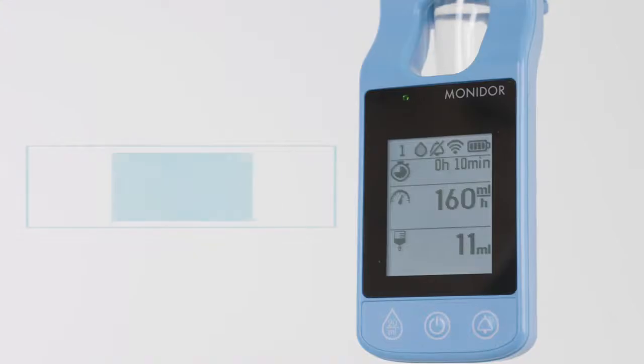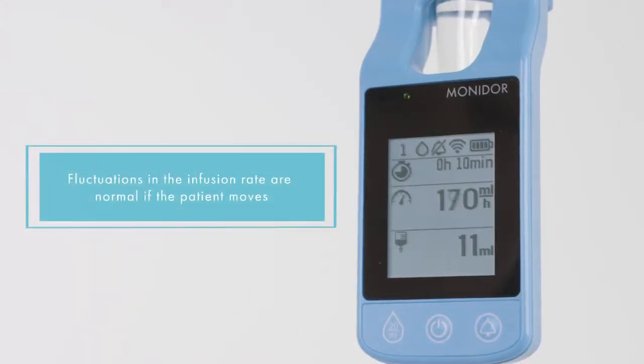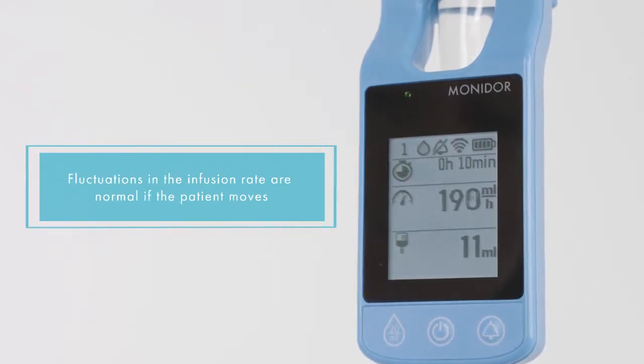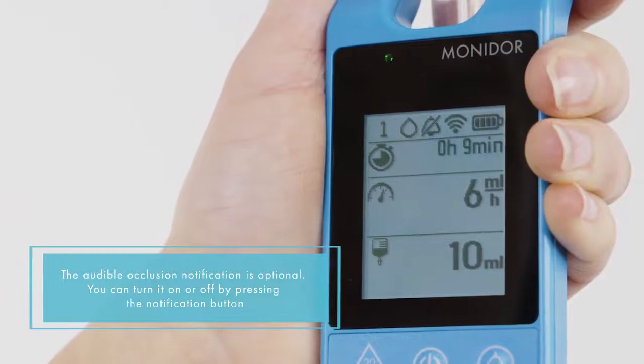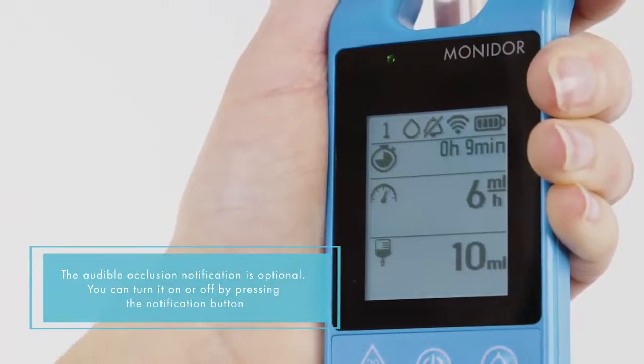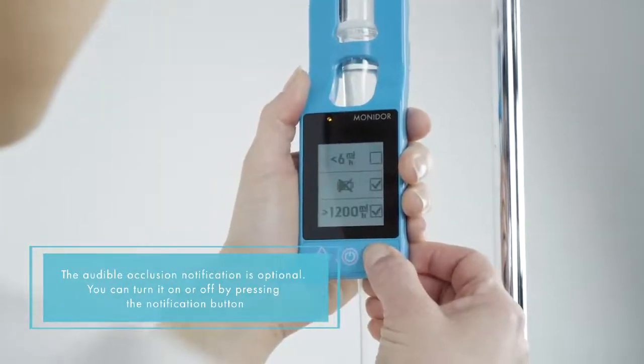The MoniDrop device doesn't adjust the infusion rate. Fluctuations in the infusion rate are normal if the patient moves. The audible occlusion notification can be turned on by pressing the notification button.